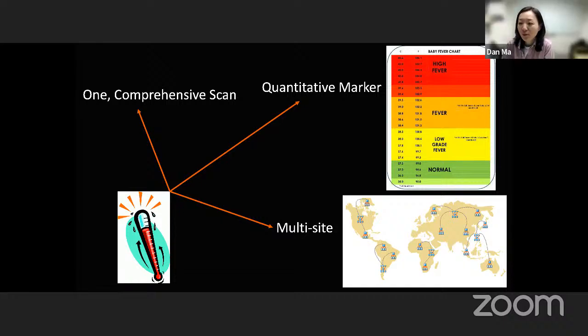It also depends on what you want to see from both sides, right? From the imaging side, of course, we can quantify T1, T2, but we also want to identify some tissue microstructure related features that directly relate to what you can see from the tissue side. For example, cell size, enlarged balloon cells. So there are some features we want to coordinate.